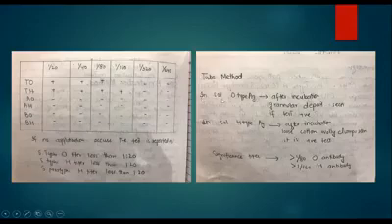In the tube method, for O antigen, after incubation, granular deposits can be seen if the test is positive, while for H antigen, after incubation, loose cotton woolly clumps can be seen if the test is positive. So you have to draw these diagrams along with the text that is to be written in the practical notebooks.